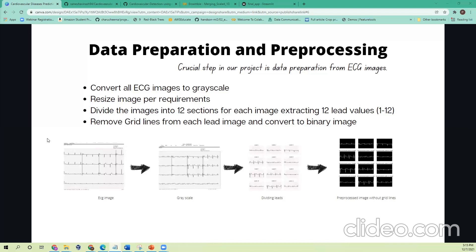To remove the grid lines, we used thresholding — specifically Otsu's thresholding — to keep the foreground and background distinction. Once the thresholding is done, we get a binary image. However, inside the ECG image there is a lot of text such as AVR and V1, which are annotations, so we have to extract only the signal and remove all the text. We do this using contouring and other techniques.